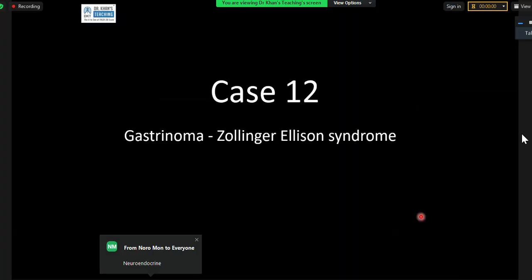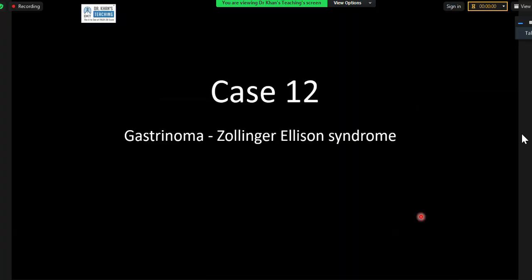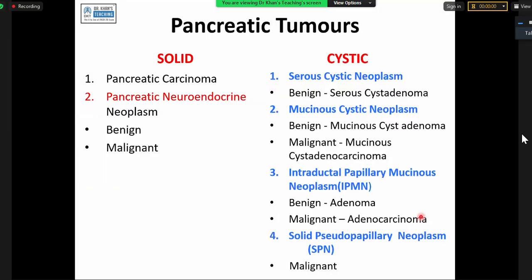This is a classical case. This is a gastrinoma, Zollinger-Ellison syndrome. Let me tell you the background of this.